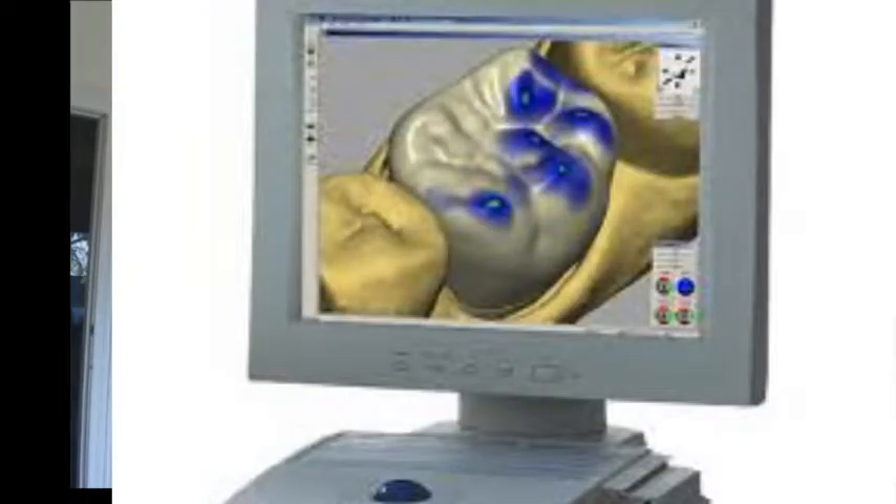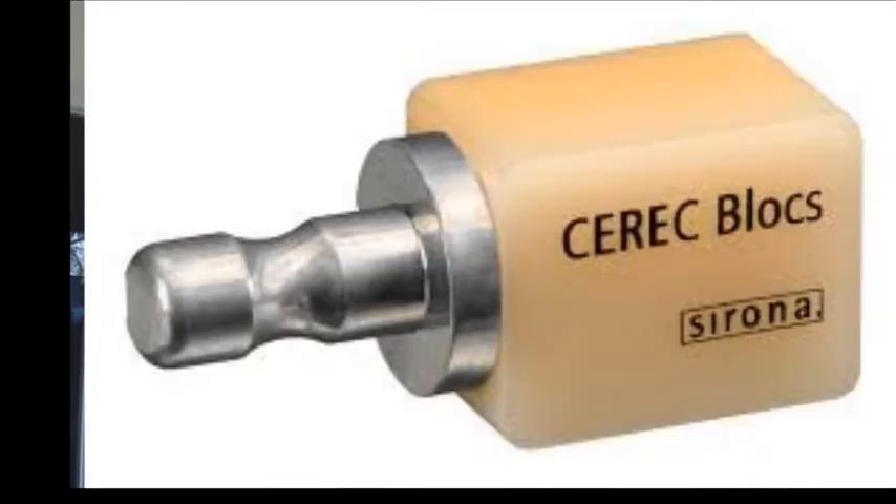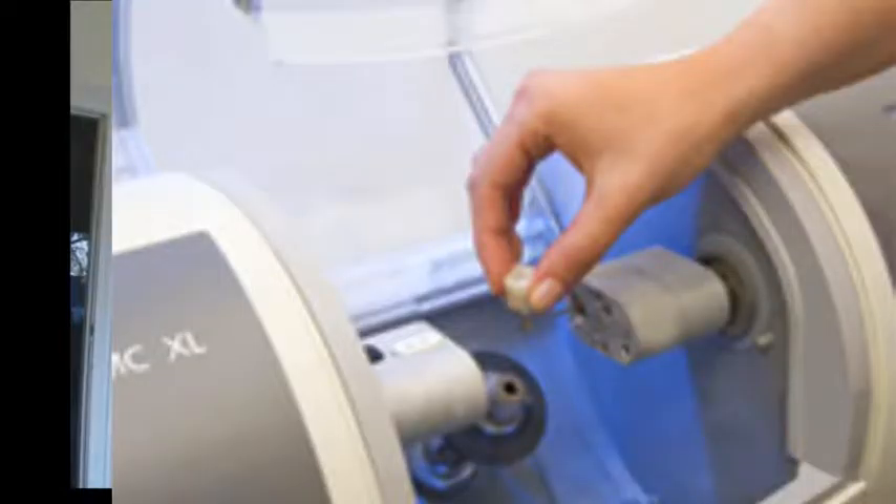Those images are then sent to a computer. You then have a seat in the waiting room for about 40 minutes or so — you have a tea or a coffee while the restoration is made up. On the computer, the restoration is designed, and once it's designed, the information is sent to a special milling machine where a solid block of porcelain, colour chosen to match your existing dentition or teeth, is used.